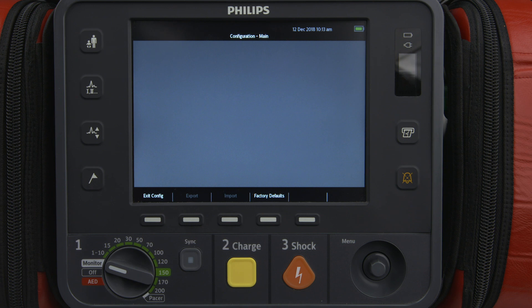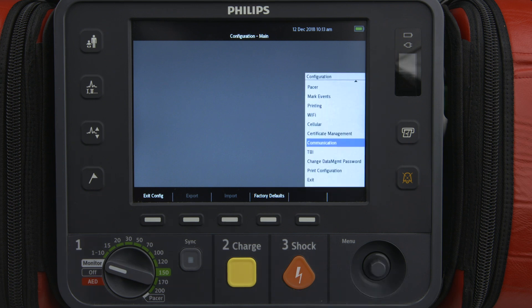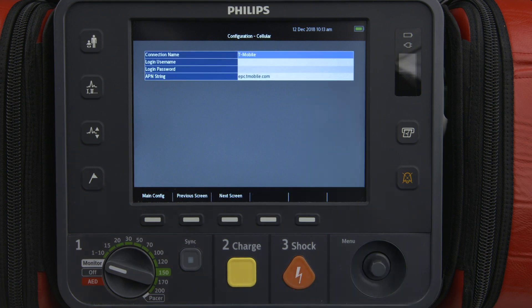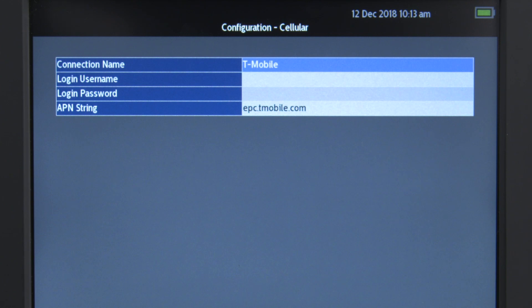If you will be using a cellular or mobile network to transmit data, you need to configure the HeartStart Intrepid for cellular mobile wireless communication. This is done from the Configuration menu — select Cellular. The Configuration Cellular screen appears. Complete the fields with information described in the HeartStart Intrepid Instructions for Use Configuration chapter. You will need to contact your cellular mobile network provider to obtain the correct access point name, APN, for the APN string field.